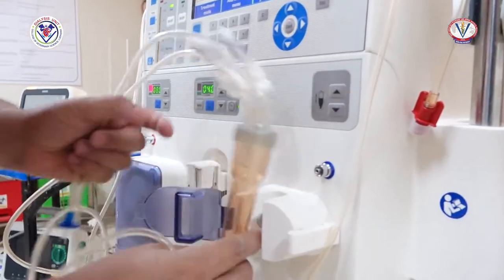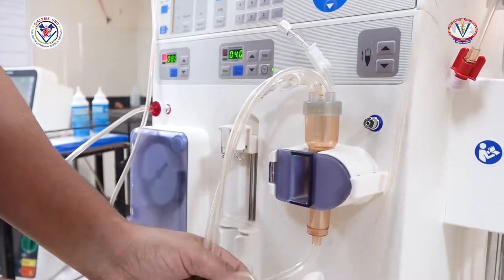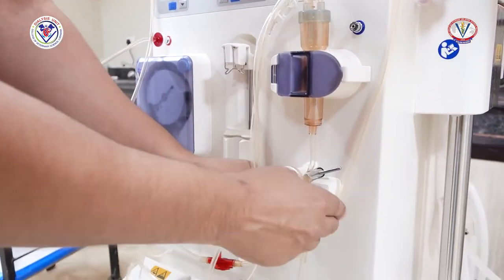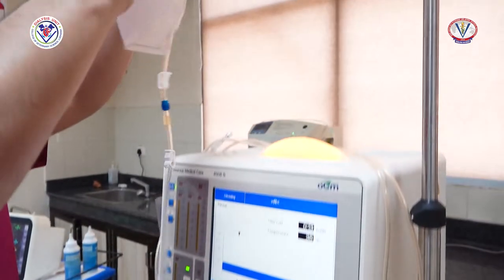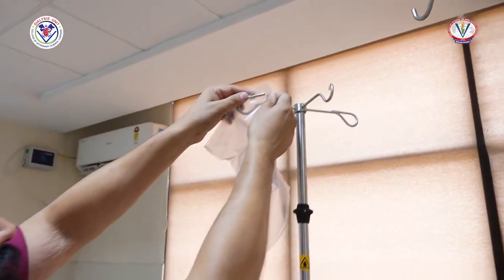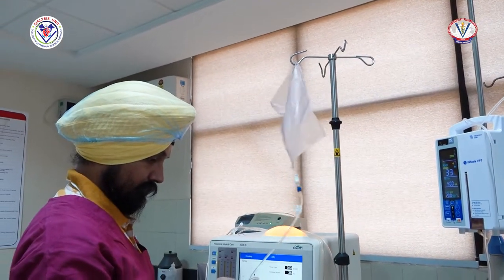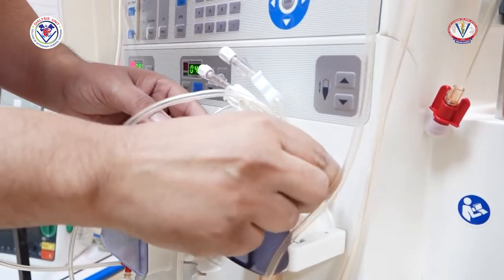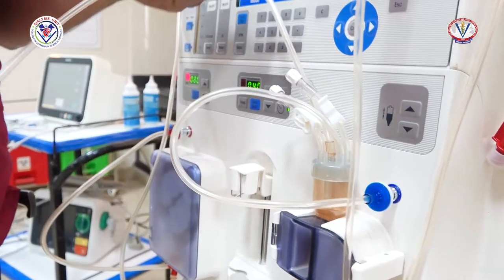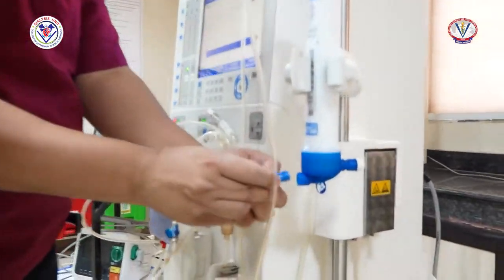Likewise, take the venous line and fix the venous chamber in the designated port. A collection bag is also attached to the venous line, in which the priming solution is collected during the process of priming. Connect the venous pressure port of the venous line to the designated port of the machine and connect the other end of the venous line to the other side of the dialyzer.